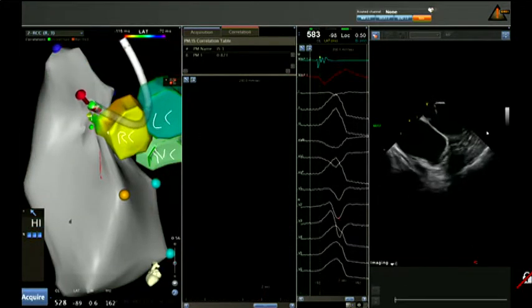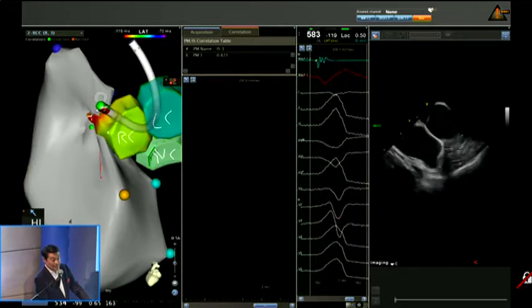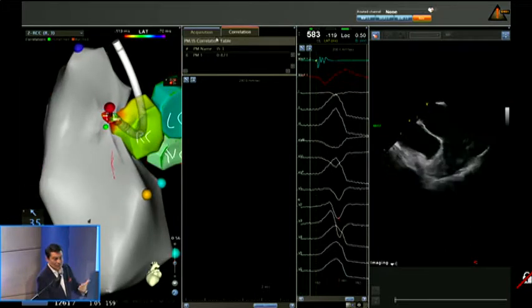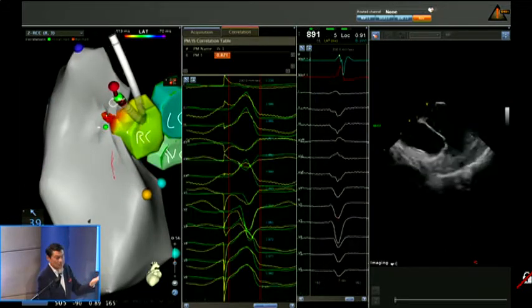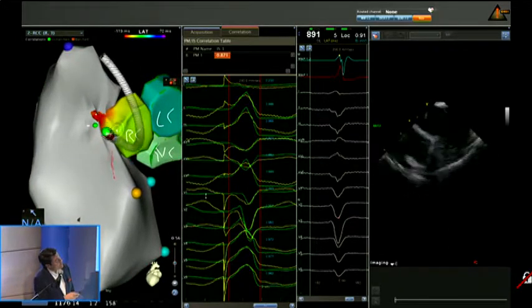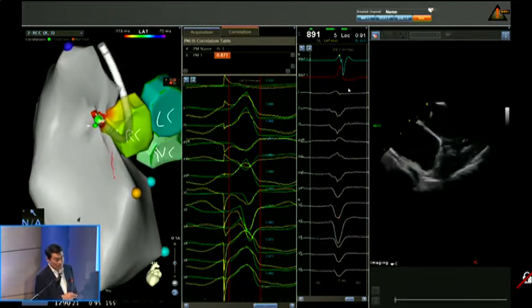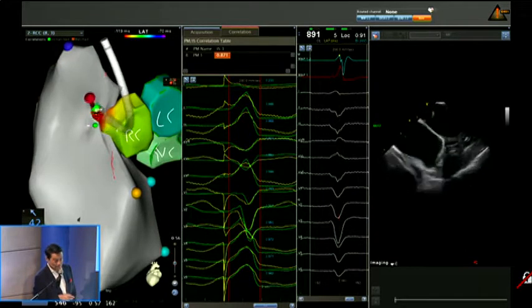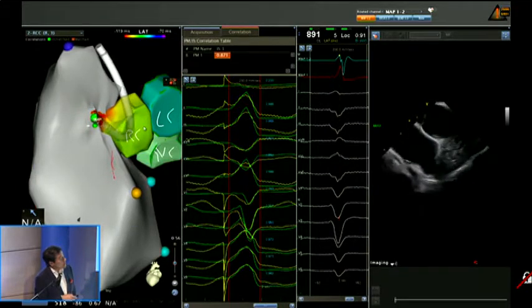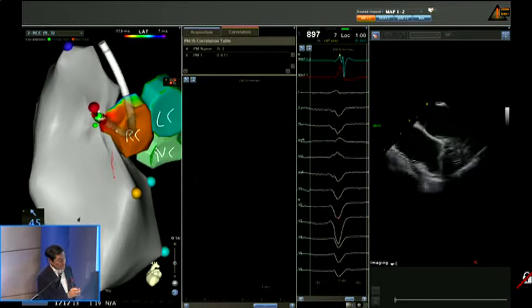So the software is showing here the average correlation coefficient lead by lead. But this is very important for every comparison algorithm, and in general, what we do in clinical practice, even when we did not have these algorithms. More important than the average itself is how much is the average lead by lead. These algorithms have sensitivity and specificity.